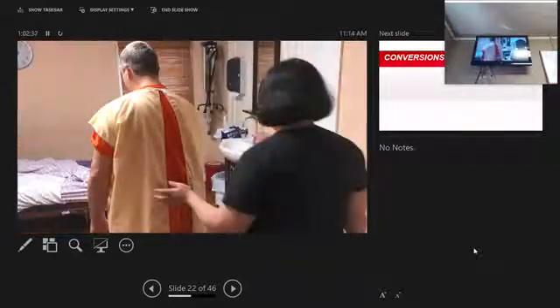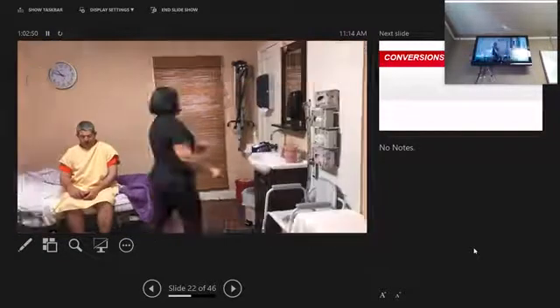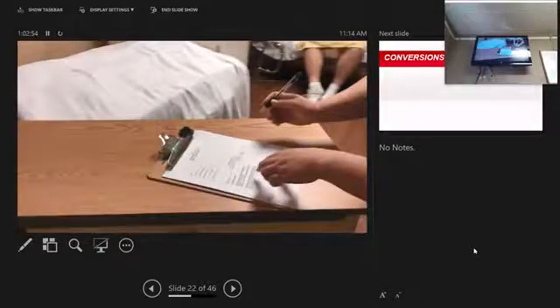Does not touch the top or the bottom here. Doesn't have to be exactly in the middle as long as it's not touching. Okay, and then we're going to add the two weights together. You would step back down off the scale. I'm going to stand beside you to make sure you're keeping it off appropriately, and we'll go back to the bed.